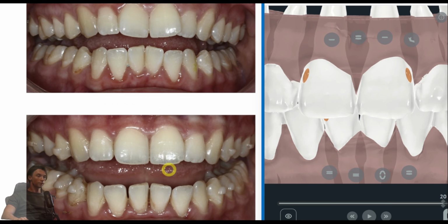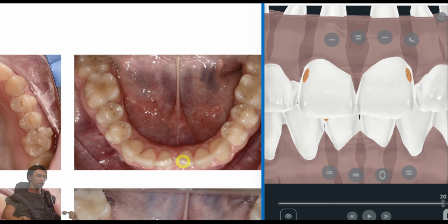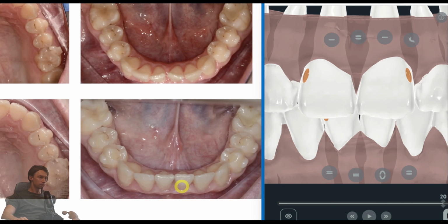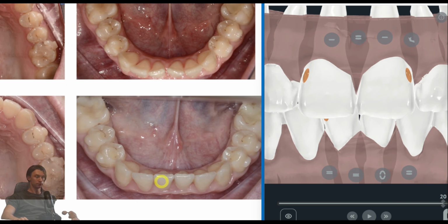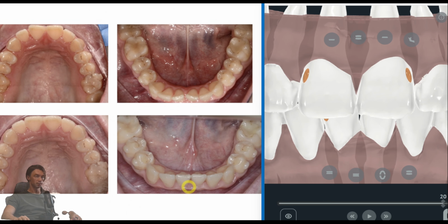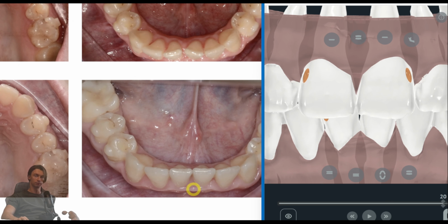We begin with aligner wear, the teeth move labially, and the round tripping process goes successfully. Gaps between the teeth are opening. I have a shot at the final stage. We still need to slightly upright the lateral incisor in the lower jaw, but the overall final result is already visible. The incisors aligned without any refinements or extra aligners. This was achieved thanks to well-planned round tripping.